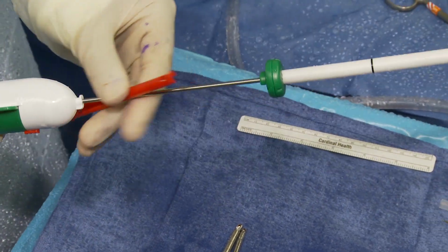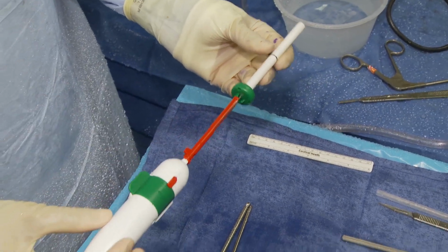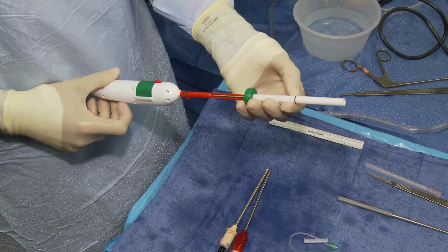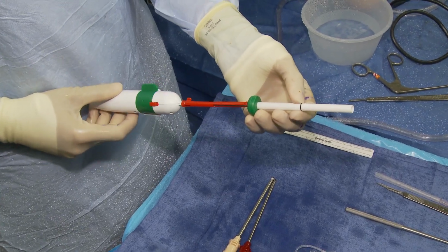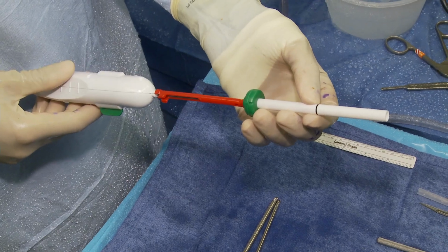So when you unpackage the device from the sterile packaging, it will essentially look like this, and that will allow you to place it into the subacromial space using this alignment line to make sure that the device is positioned appropriately within the subacromial space.